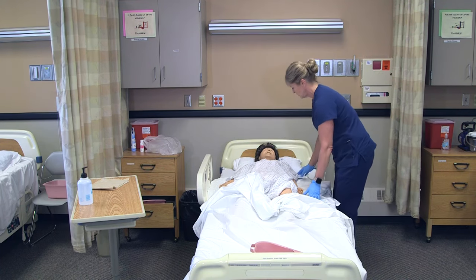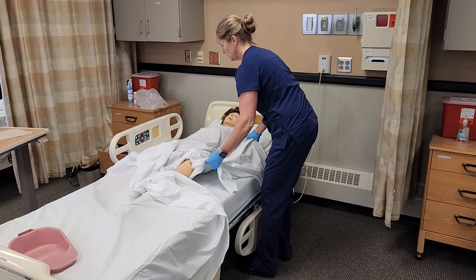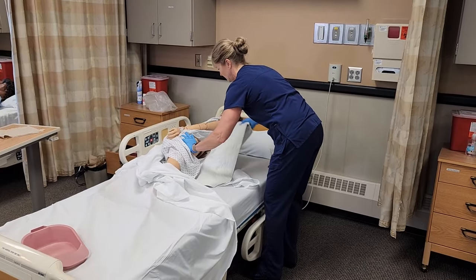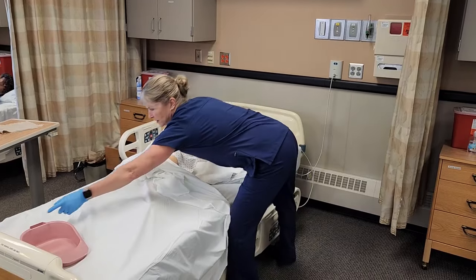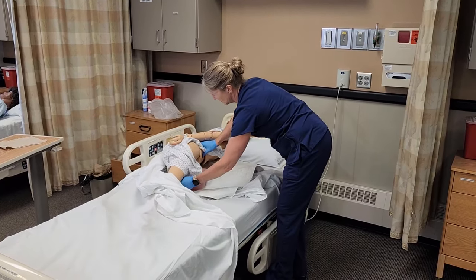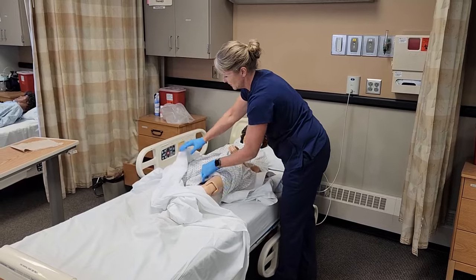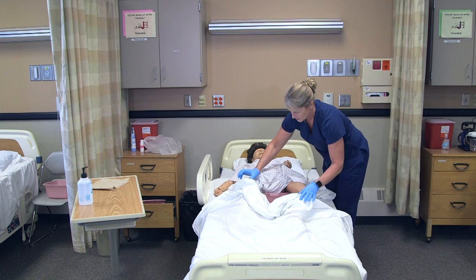I'm going to make sure her arm is out. 'Annie, I'm going to have you roll to your right on one, two, three.' We'll have her roll that way, then I'll take the bedpan and position it underneath her bottom so that when she rolls back, she's right on top of the bedpan. I would look from the front and make sure she's positioned well and that it's not bothering her.